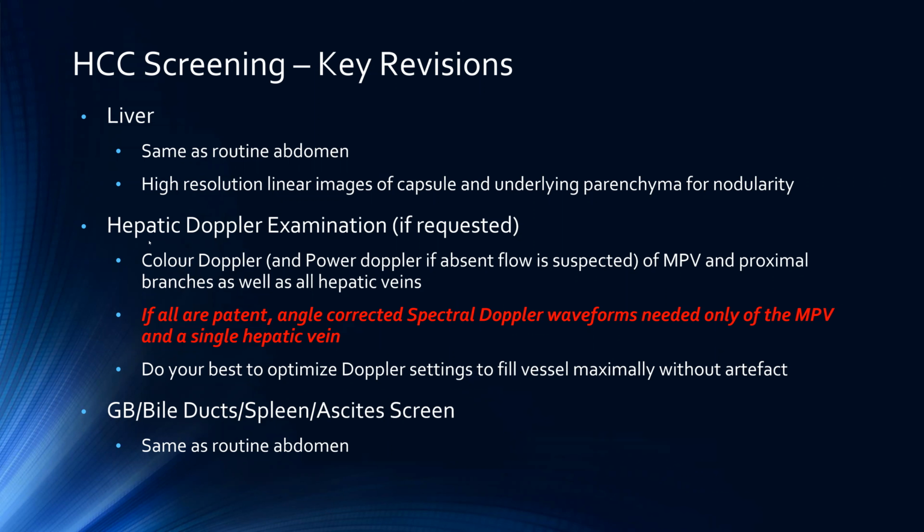And then in terms of the hepatic Doppler examination, specifically if this is being requested as part of the HCC screening exam, we do a little bit more of an extended color Doppler exam of the portal and hepatic venous system.